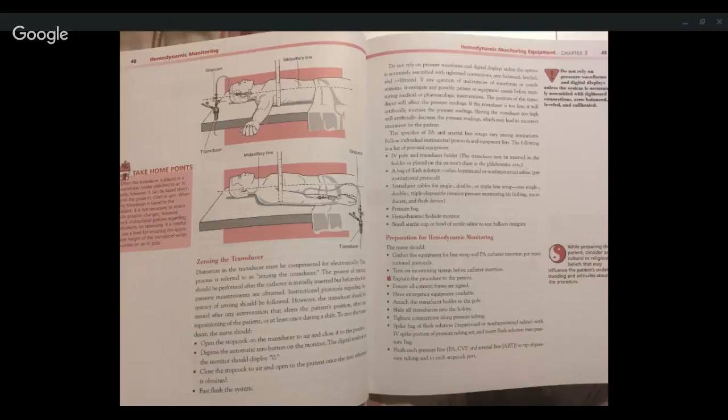A bag of flush solution, often heparinized or non-heparinized saline, per institutional protocol. Transducer cables for single, double, or triple line setup. One single, double, or triple disposable invasive pressure monitoring kit. Tubing, transducers, and flush device. Pressure bag, hemodynamic bedside monitor, and a small sterile cup or bowl of sterile saline to test balloon integrity.